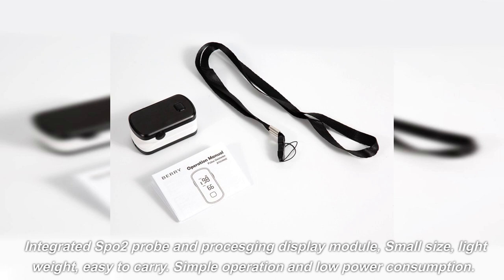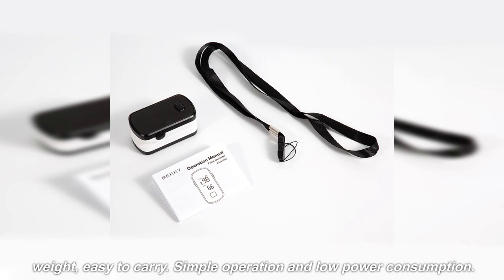Integrated SPO2 probe and presedging display module — small size, lightweight, and easy to carry. Simple operation and low power consumption.